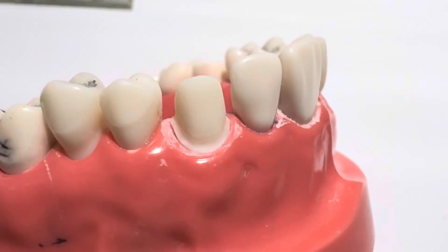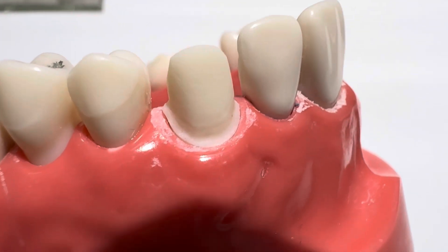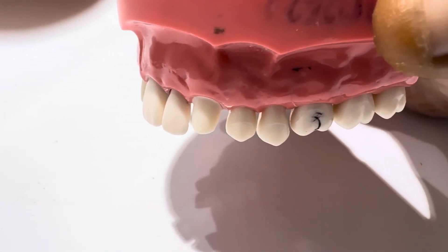Step 7: Final checks. Check occlusal clearance using wax strips or putty index. Ensure uniform reduction — labial, lingual, incisal.